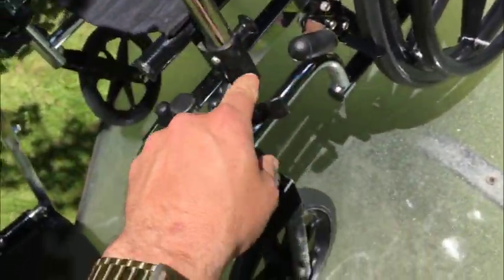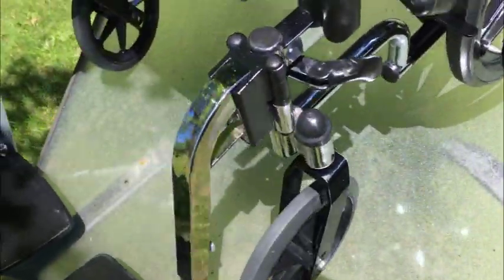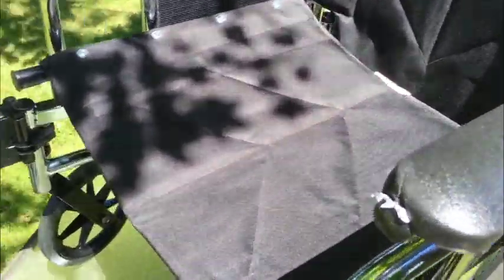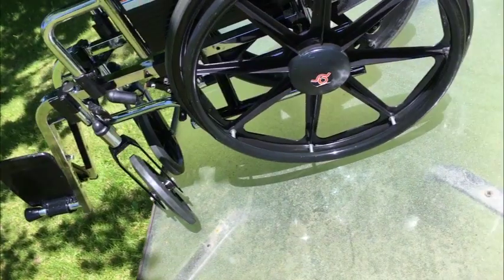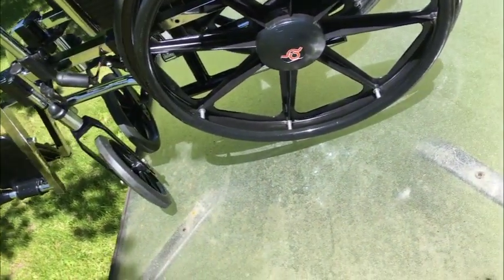Adjustable handlebars — you just simply lift that and it'll go up and down. It's a good chair. Folding is easy. I'll try and do this one handed — basically just like that. And put it in the trunk of your car.